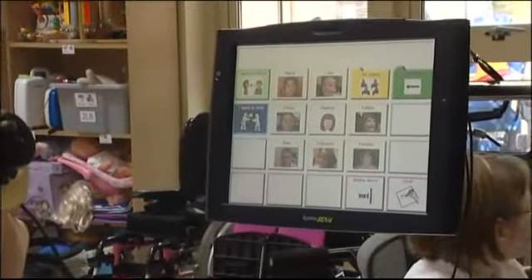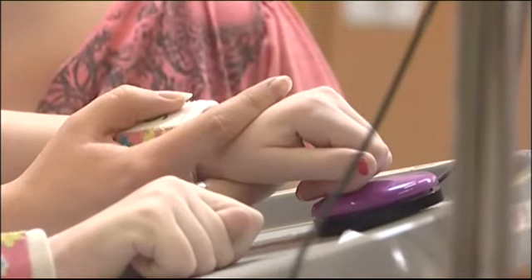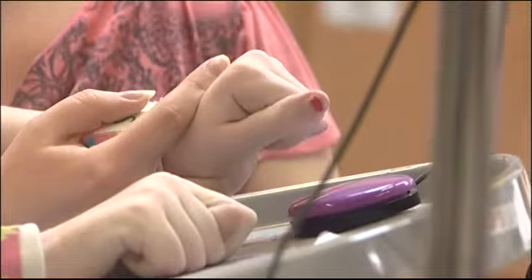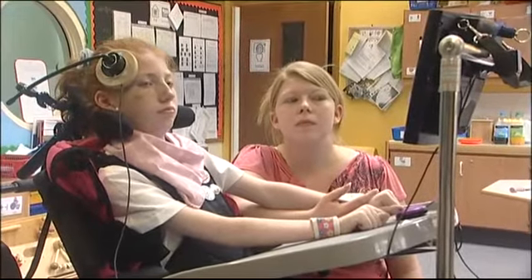On the right page. Yasmin was using a device called a Dynavox DV4, which is set on a 2-switch scan. Yasmin is supported in her scanning by Emma to provide some stability to the hand to help reduce her spasm and to keep her hand within range of the switch. And she also uses a head switch, which she turns her head to activate.